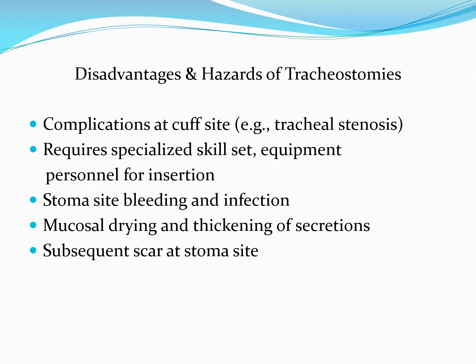Mucosal drying and thickening of the secretions is a further concern, because we know that the nose in particular is one of the mechanisms that not only allows us to smell, but it also filters and helps humidify the air that we breathe in. With a tracheostomy tube, that's bypassed.